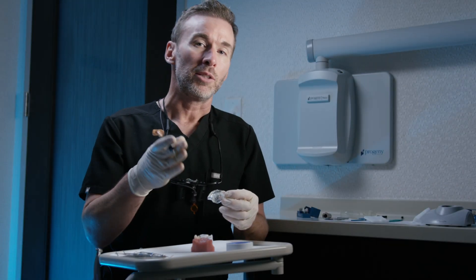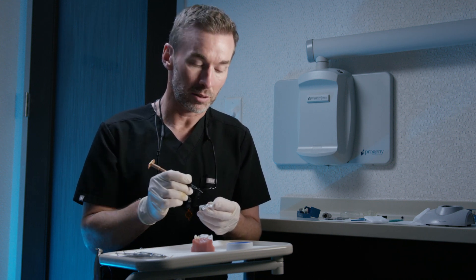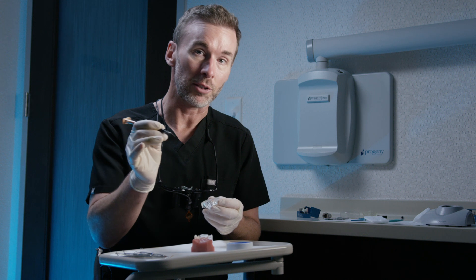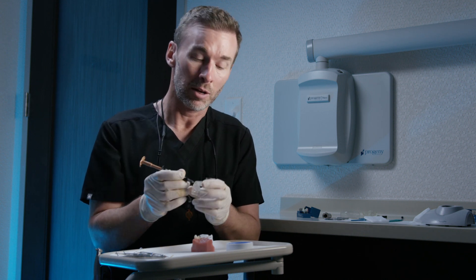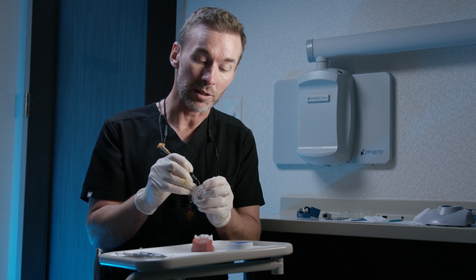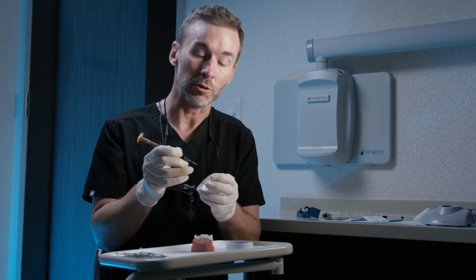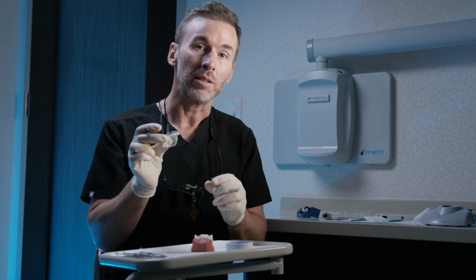At this point, you've isolated the adjacent teeth with Teflon tape and we're ready for the injection molding process. But before you take it to the mouth, I want you to verify a couple things. First, ensure that you can take your flowable tip and easily visualize where your channels are, both on the incisal edge as well as mid-facial. Make sure that you have easy access and this isn't going to become a problem once you take it to the mouth.